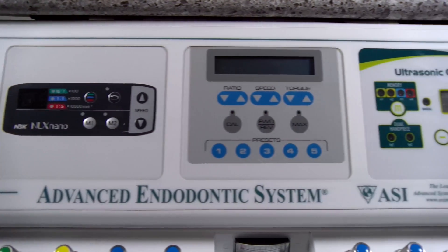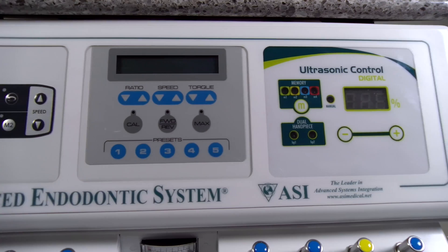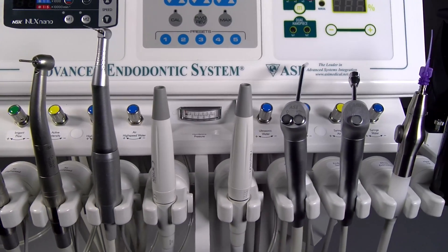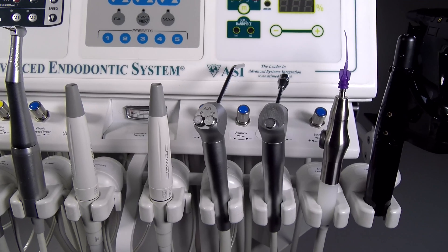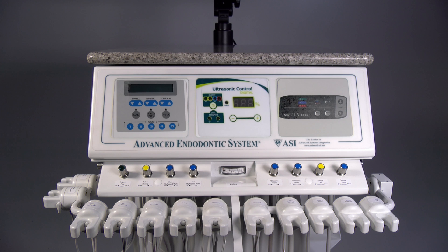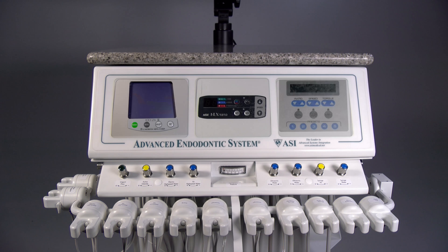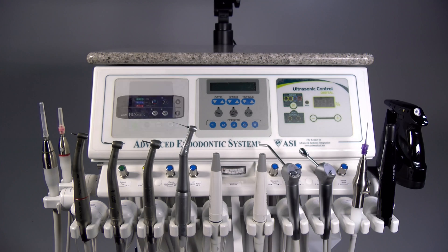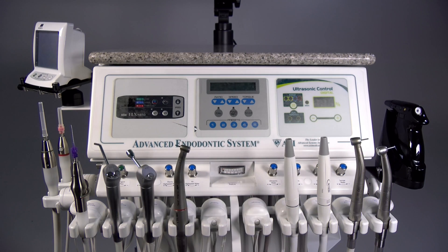The system features ASI's unique modular control panel design that allows a variety of instruments to be integrated internally with operation from only one foot control. The modular design allows customized configuration with electronic instruments of choice to be placed in any order, and eases upgradability in future years as instrument technologies change.